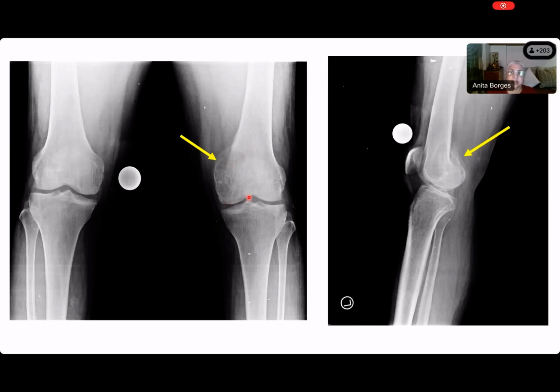So it looks as if there is a metaphyseal component to this lesion as well. You can see this when you see it in a lateral view. Very good. And anything else you want to say? Is it just one nice bubble, or do you see some trabeculations in this lesion? Trabeculations are seen. There are trabeculations within this lesion. Very good. And what is the zone of transition? We need to talk about the zone of transition.